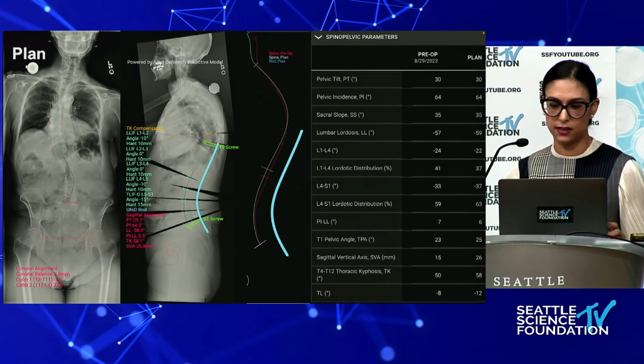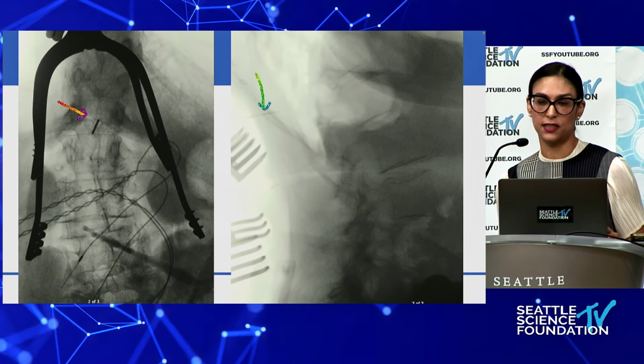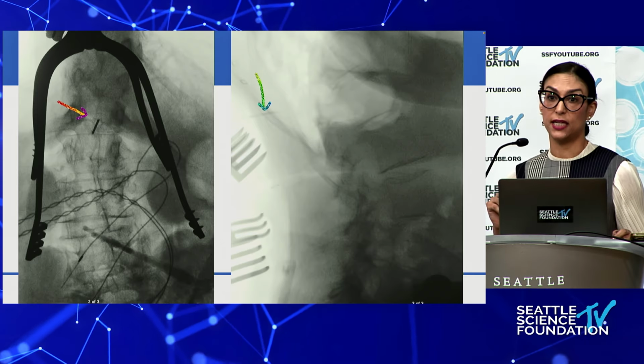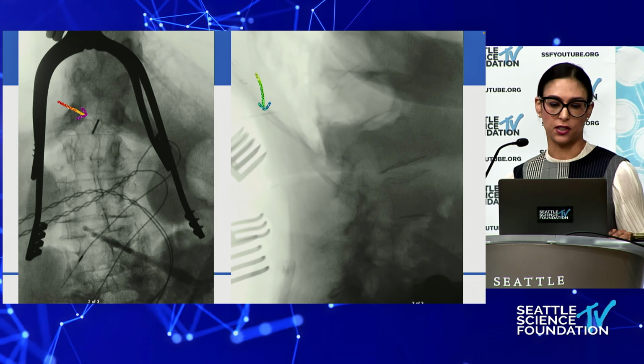So in terms of the case steps that I use, first one is I do make a midline incision. This is something I learned from Dr. Anand. The cosmesis is basically much nicer if they have one skin incision on the midline as opposed to multiple poke holes on either side of it.